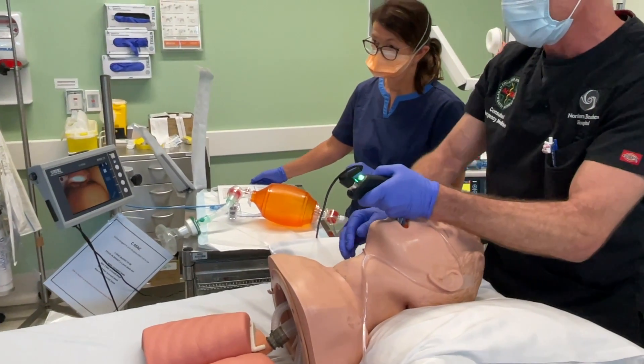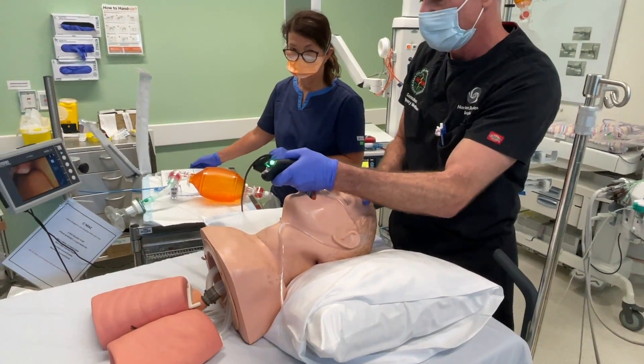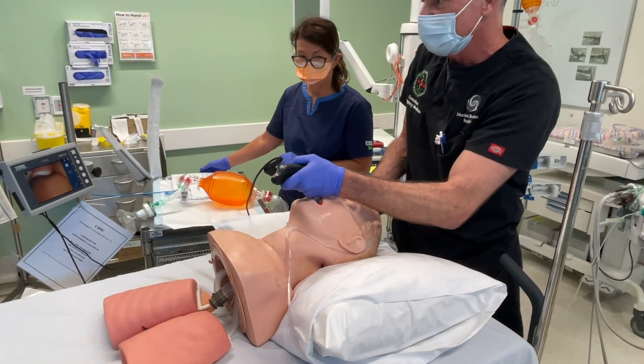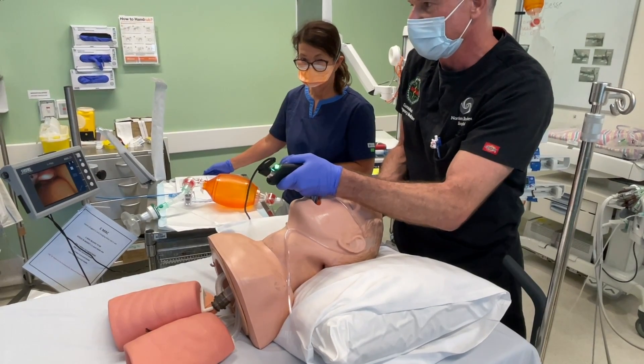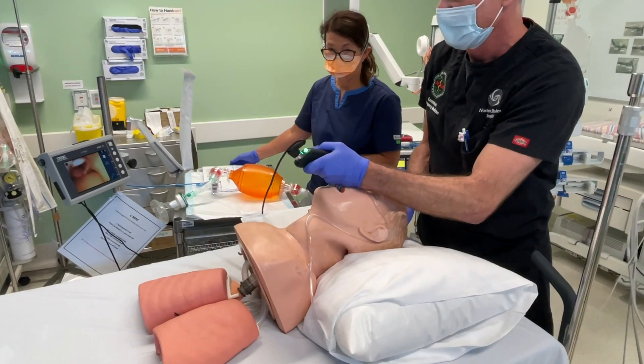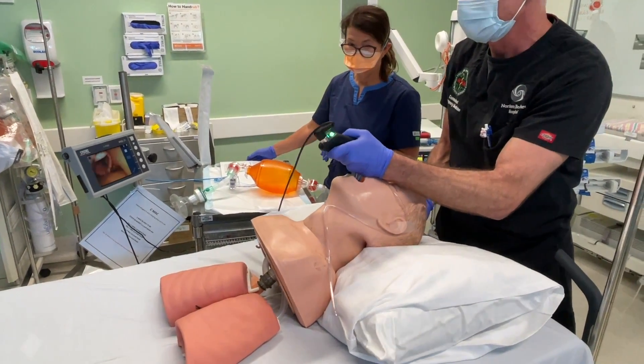If that doesn't work, we can try more head elevation. This patient is well positioned, ear to sternal notch, but if we hadn't adequately positioned them — as a large or obese patient — we may need to lift the head and shoulders more, particularly the head. Lifting the head more opens up the view. You can see on the screen as I lift the head, I'm getting a better view each time. So: external laryngeal manipulation, lifting the head.